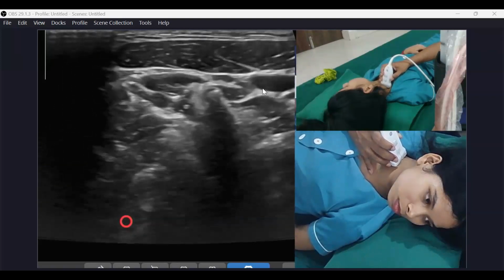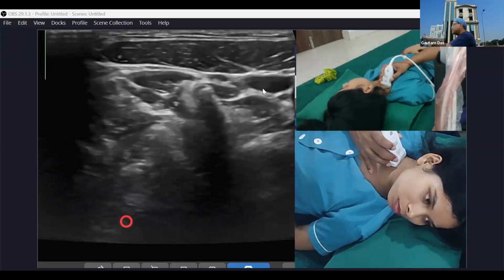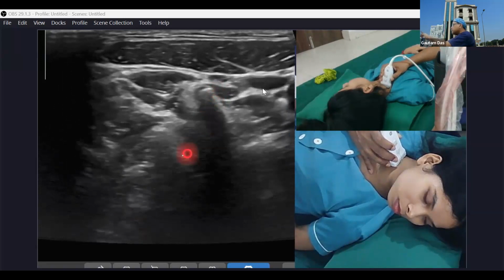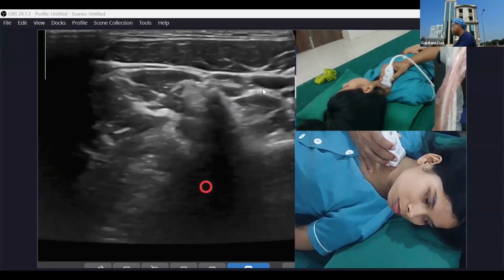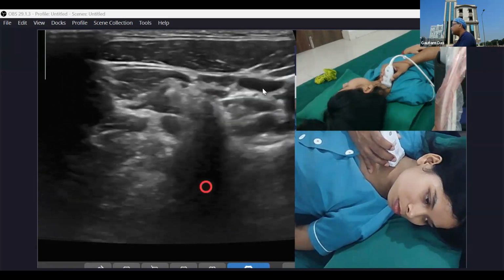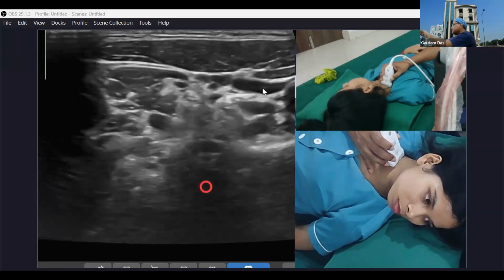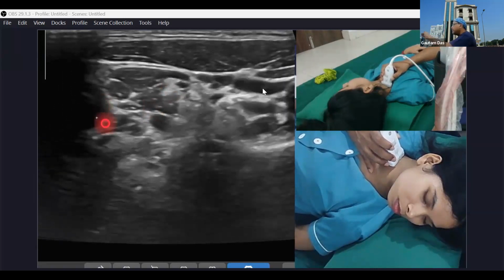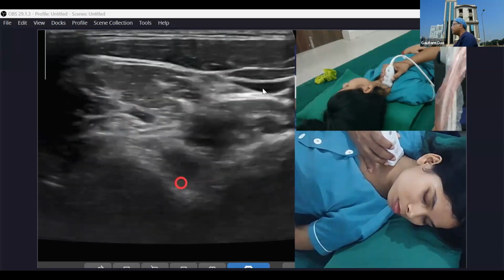Vanishing within. Everybody can appreciate it. So this was your anterior tubercle, this was your posterior tubercle, and in between, the C6 nerve root is coming out. If I bring my probe down, you see the C6 nerve root coming out very nicely, and this muscle is your anterior scalene, this muscle is your middle scalene, and it goes in between the two scalene muscles.